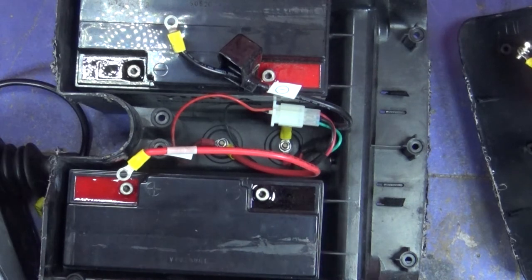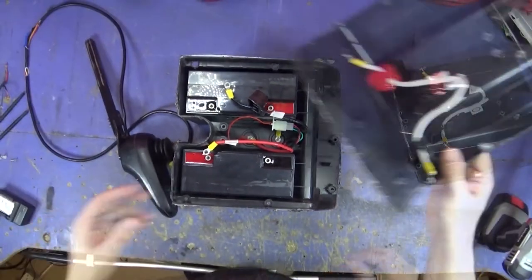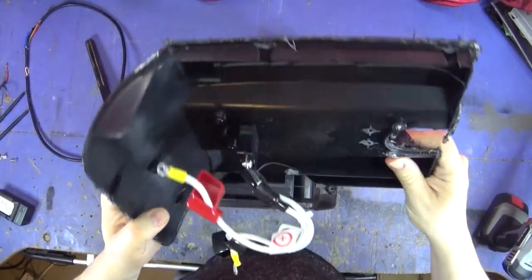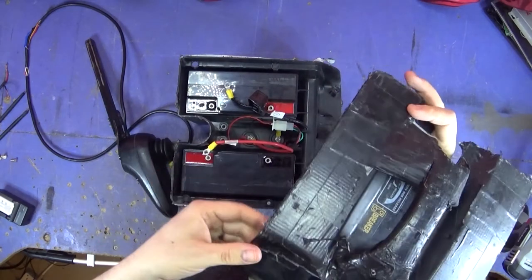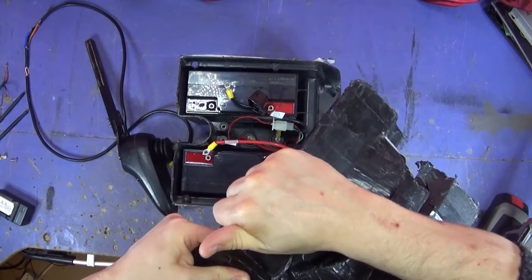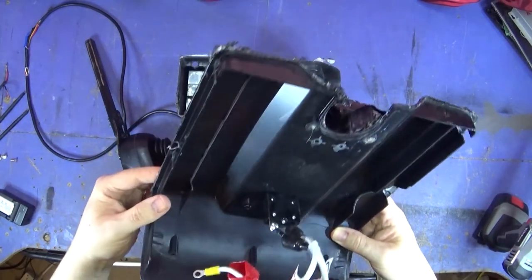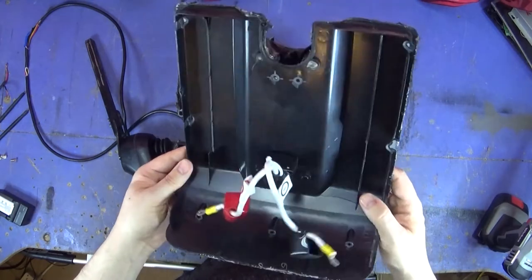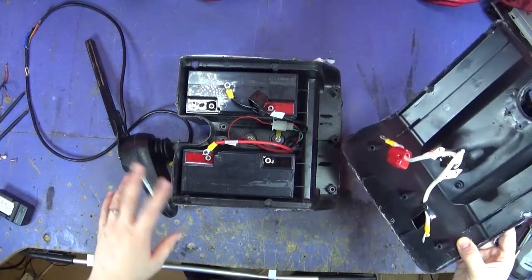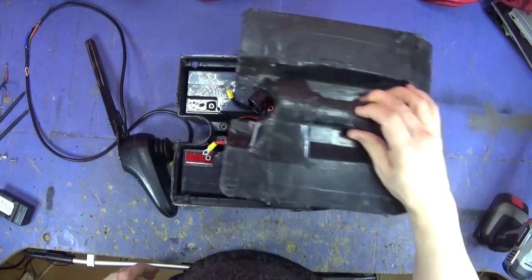I don't know what to do about this box because there's not very much I can really do about it — it is absolutely destroyed. I could glue it all back down, but it's still going to look awful, and we'd still need to come up with a way of closing it properly. Unless I do what was done before and just gaffer tape it all down, but it doesn't look too sexy, does it?